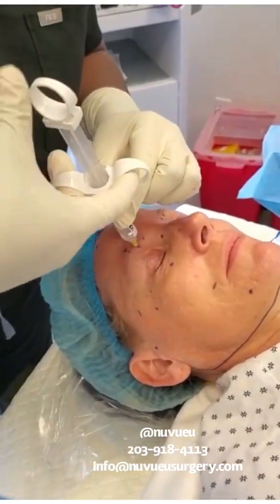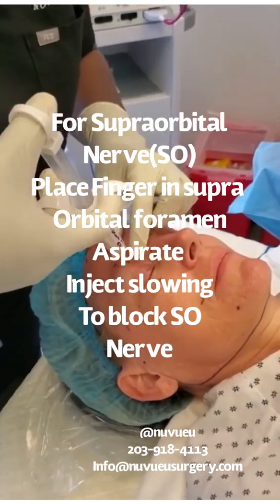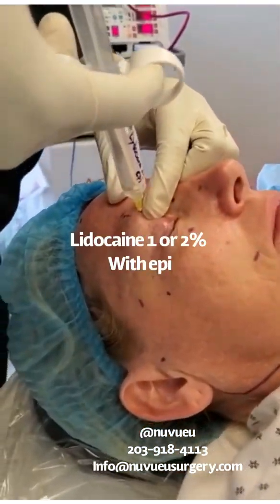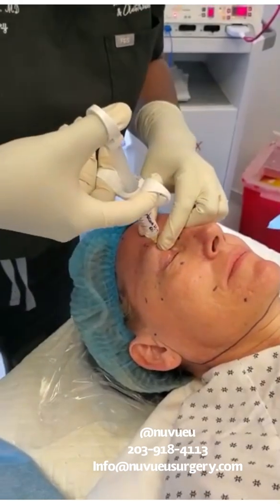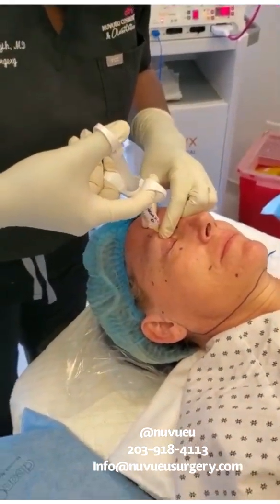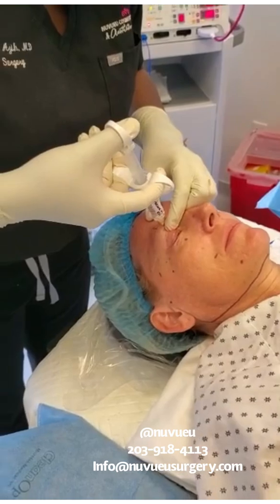Make sure that you're not in a vessel. With your finger up protecting the area, you want to gently warn the patient — you're going to feel some pressure and some discomfort as well. So you put in one cc in that area.